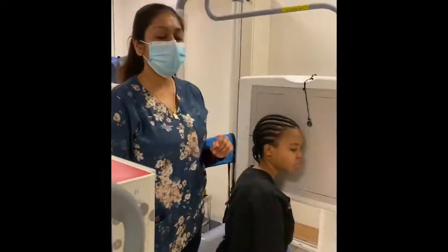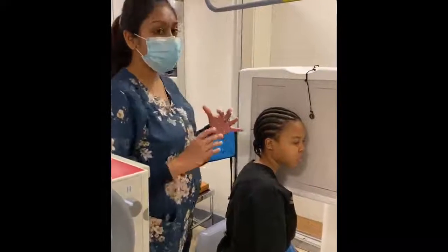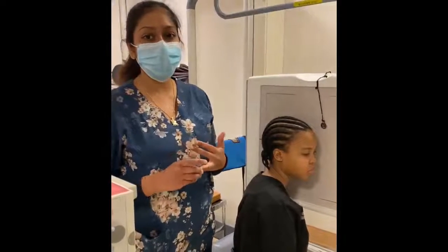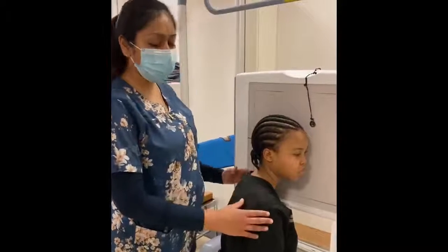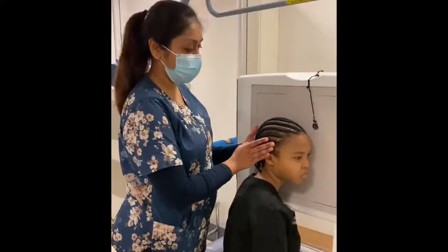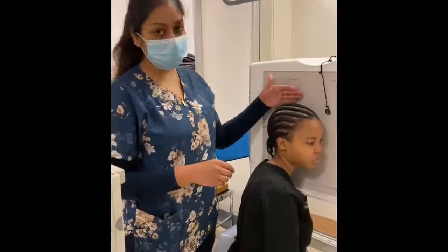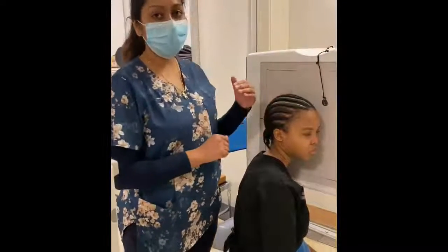Okay, so we're starting with the lateral view of the facial bones. In terms of your patient positioning, your patient can be lying down or can be erect or sitting. The idea is just so that your patient is nice and stable. What we're going to do here is oblique our patient. The patient's in an oblique position, and we need to turn the patient's head in a true lateral position. When you are turning your patient's head, make sure that the area of interest is against the image receptor. So if it's the right, you would do a right lateral. If it's the left, you're going to do a left lateral.